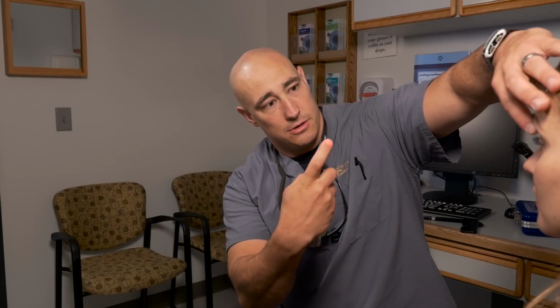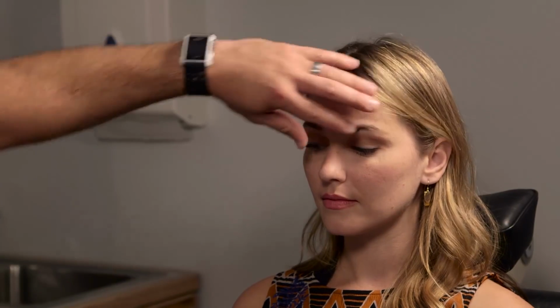And it's okay, I'm just going to gently lift your eyelids up. And so what I'm going to do here is just to make sure that they can move their eyes all the way down, I'm going to hold the upper eyelids up just so I can get a really good view. You're doing fantastic. Next thing we're going to do is check the intraocular pressure. So whatever device you have available to you, use it.